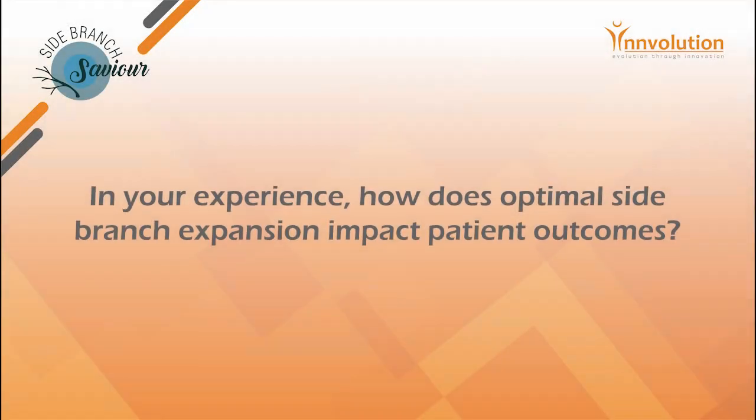Success in side branch intervention depends on immediate success and long-term success. Immediate success is purely based on your pinching and TIMI flow. Also, if the side branch is quite big and you feel there's a significant pinching, there is a role for doing an FFR through the main struts into the side branch, assessing whether it's significant, and then intervening if required. Long-term success depends on the clinical symptoms of the patient, and further imaging can also be done as a follow-up.